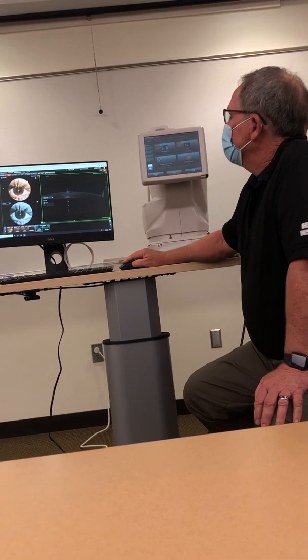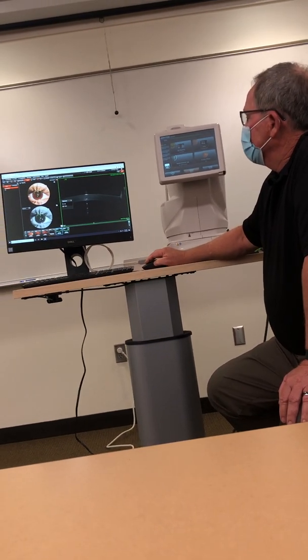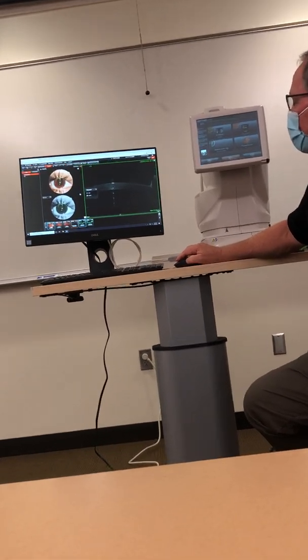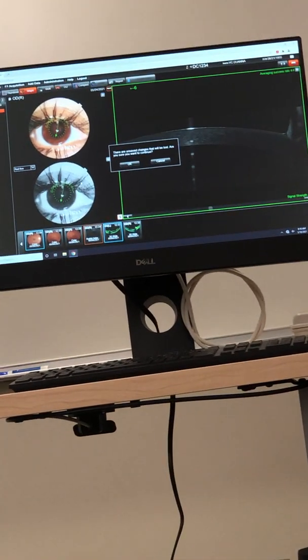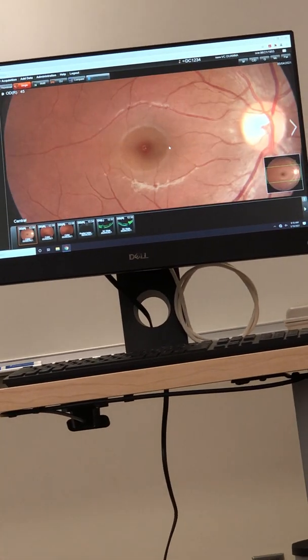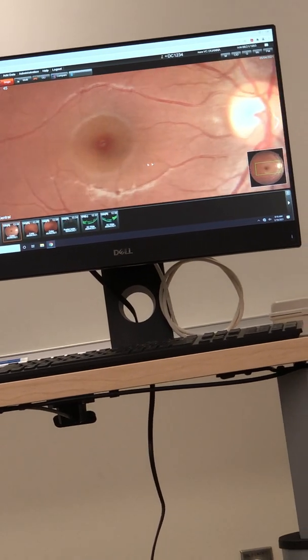Can you magnify that photo a little bit more if there was like an iris cyst or anything you were interested in? Yes, we can. It would be a photo like this. Alright, but just more. So that's cool. So you'd be able to do that.